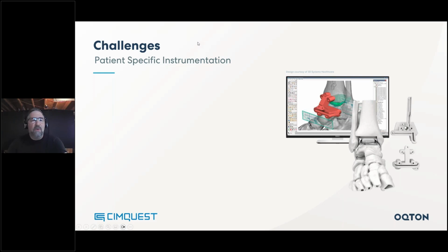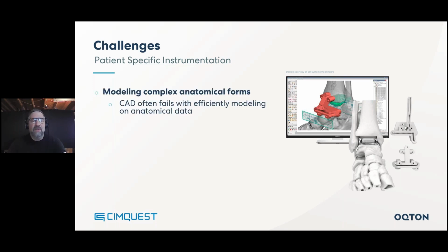The challenges for patient-specific instrumentation: it's on the rise. It's been proven to give better treatment than generic solutions. Designing devices in a healthcare environment has very unique and specialized requirements and challenges. How many of you have ever tried to do any type of medical modeling or modeling on organic data using traditional CAD software? You know that it has its limitations. You know that oftentimes it's fraught with peril. It can fail. It can give you endless amounts of frustration.